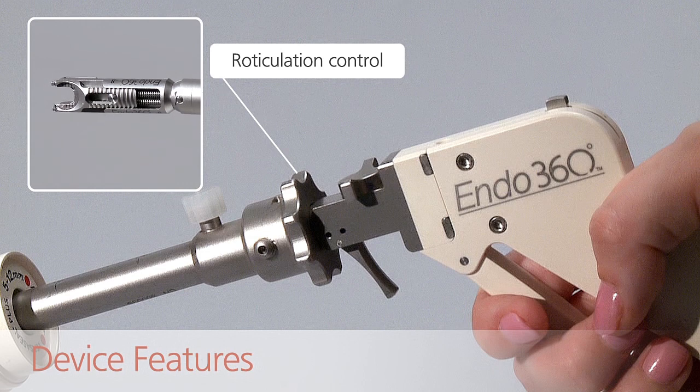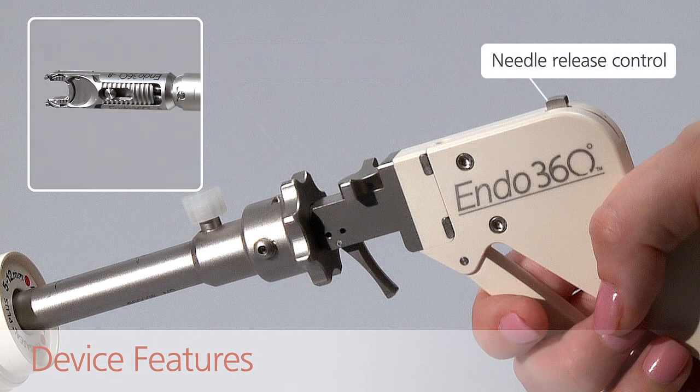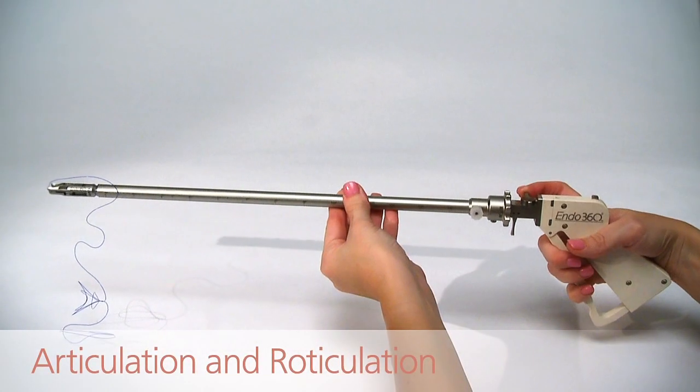The roticulation control spins the device shaft 180 degrees. The needle release control allows the operator to release the needle from the device at any time.